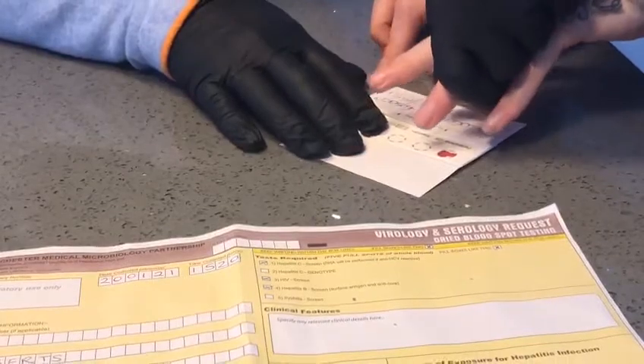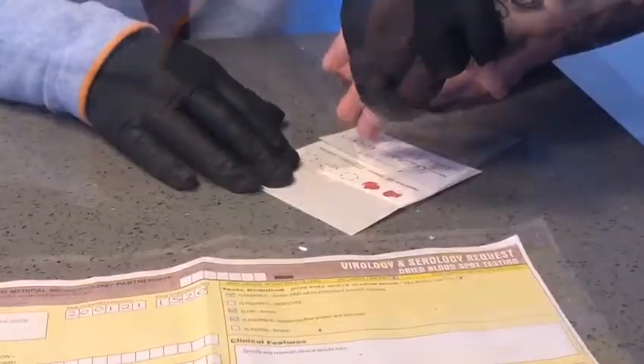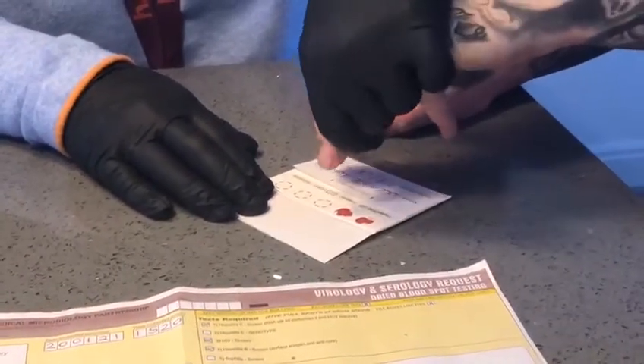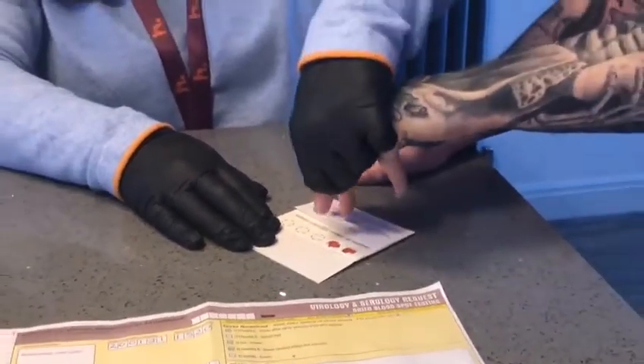Rubbing the finger like this will improve the blood flow. If you're not having much success, you can always use another lancet and take a sample from another finger. This does sometimes happen when the hands are cold.